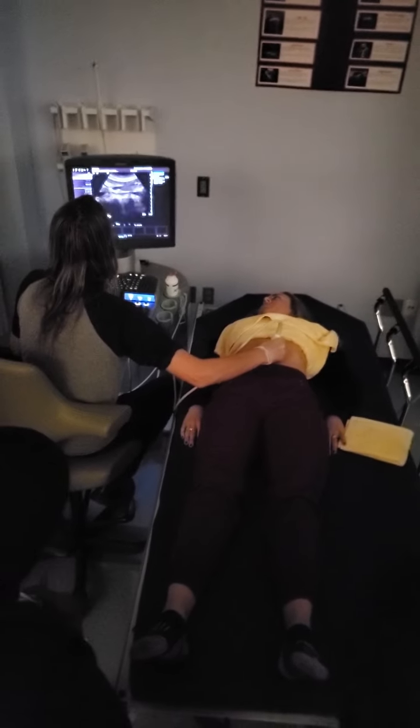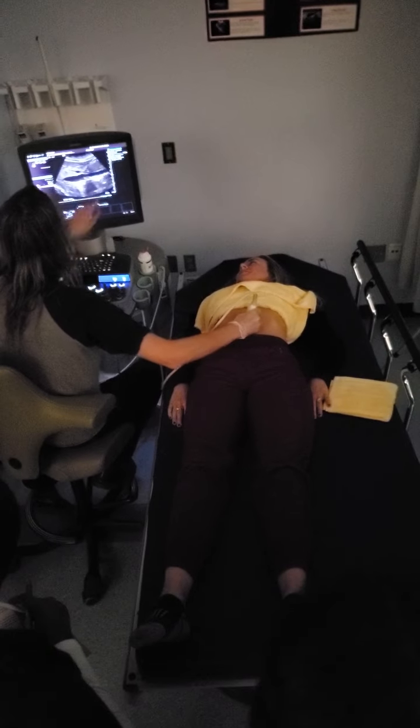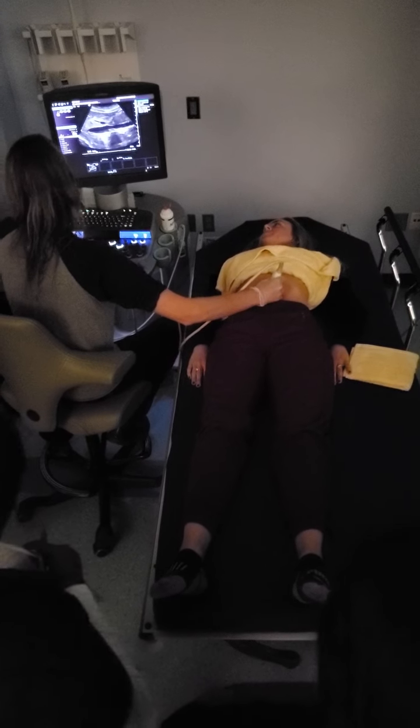Get that inferior border. Not in a drinky way. Okay, so we've got pancreas here. You guys don't know that yet, but here's that tissue of the inferior, right in here. So that's our next image.